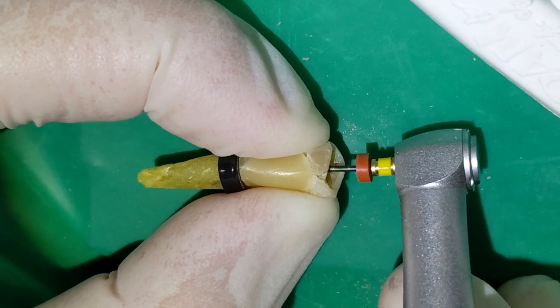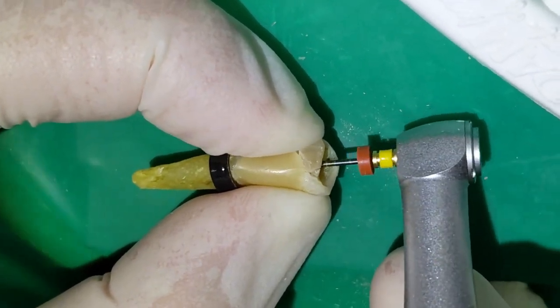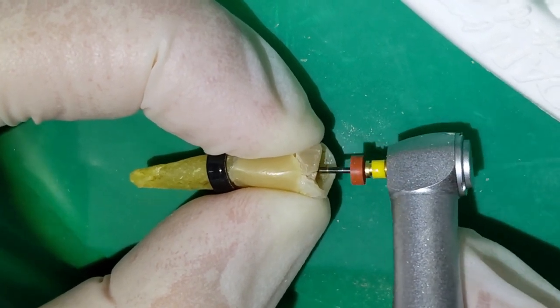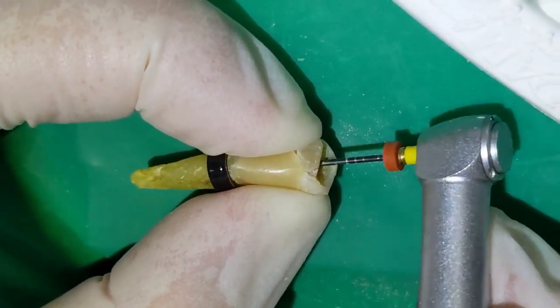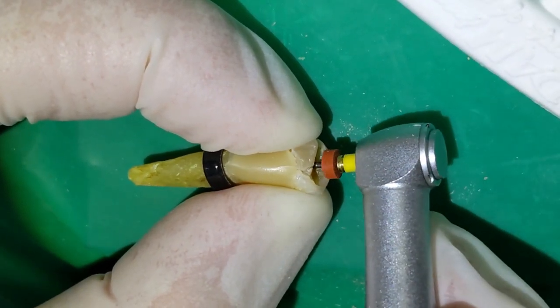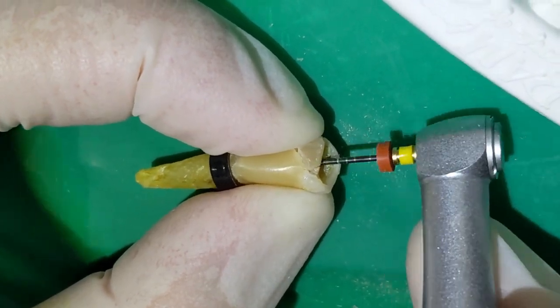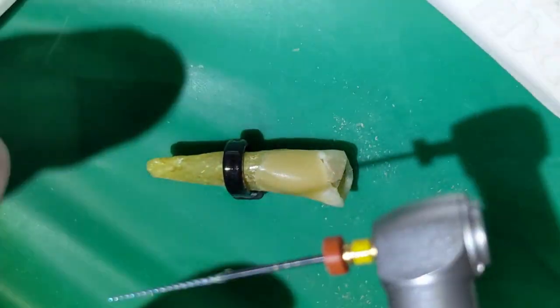So in between each file too, we would rinse out the inside of the tooth with the sodium hypochlorite. Because in addition to disinfecting, the sodium hypochlorite will also dissolve any of the nerve tissue or blood vessels, any bacteria that's in the tooth while we're cleaning it out.